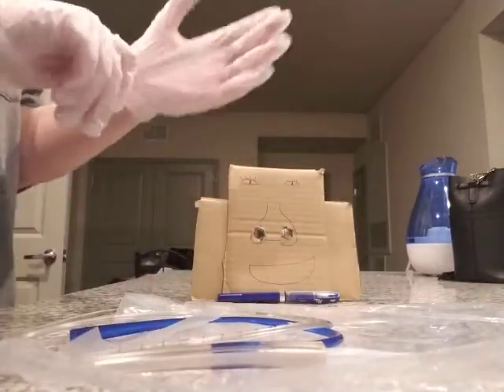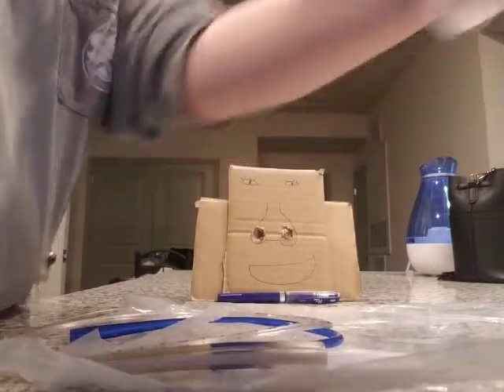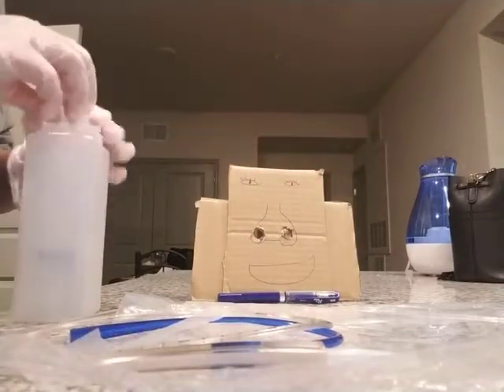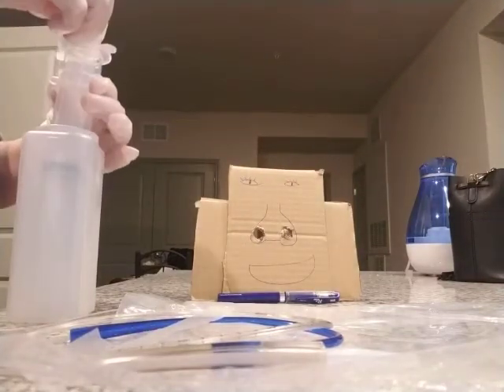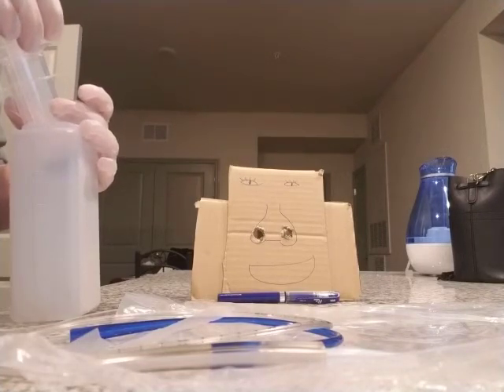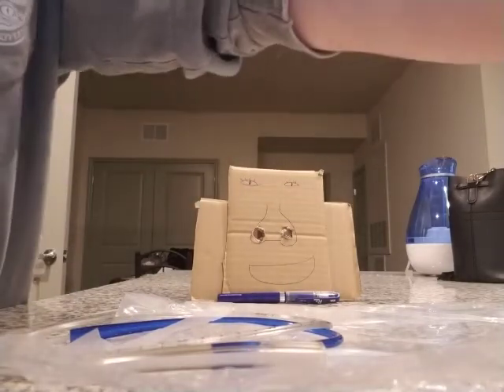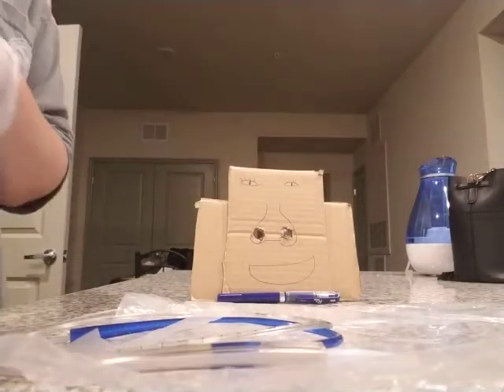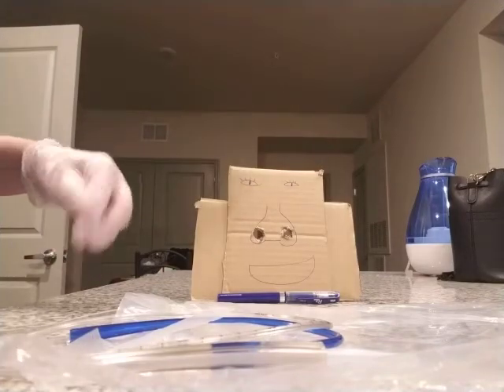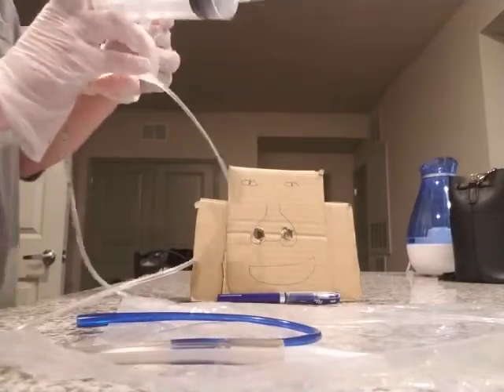I'm going to grab my syringe and sterile water and draw up 10 milliliters of water. Okay, put my sterile water to the side. I'm now going to connect the syringe to the tube.